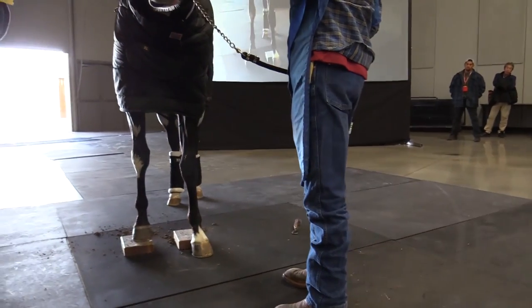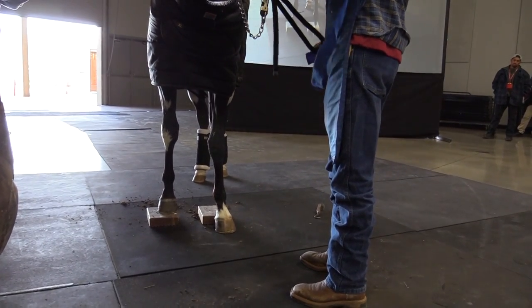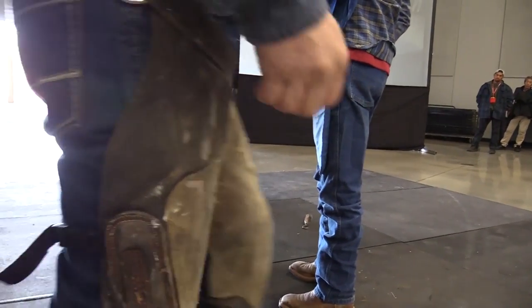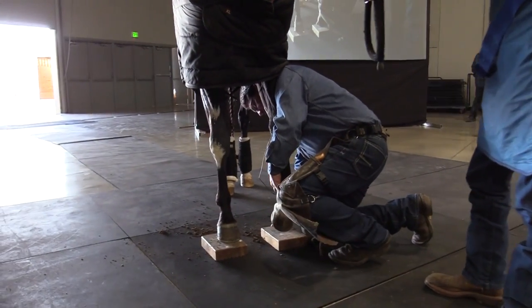It's also important to know how the x-rays are taken. If they've been taken with one foot on a block and the other foot setting off, then it's hard to evaluate your joint spacing. And honestly, I don't really believe many x-rays that I don't take myself when it comes to the joint, because even when I take them, I wonder if he leans just a little bit.